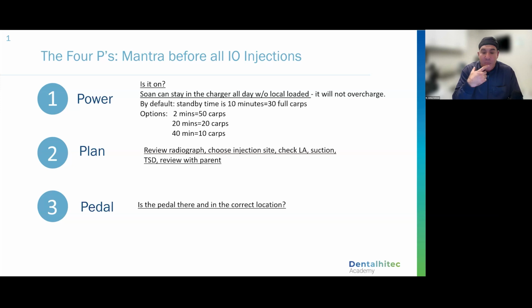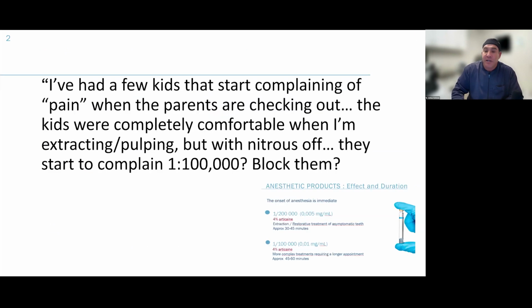One issue that we've had with some doctors, they said, I've stepped on the pedal. I'm sure my foot is centered, but it's not communicating with the unit itself. It works by radio waves, so there's not a battery in this. And what we think is happening is some of these big, like in my office, like these big ADEC chairs, and it's just not getting a signal all the way through this chair, right? There's a lot of metal and plastic there. So you may want to have your pedal just to the side. And then we want to make sure that our positioning is correct.